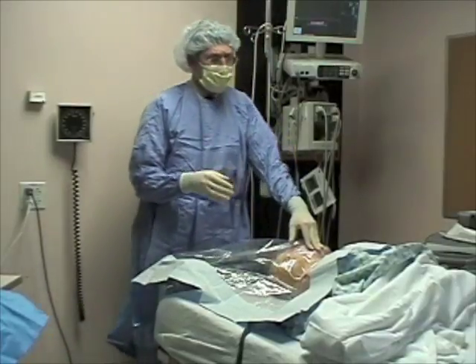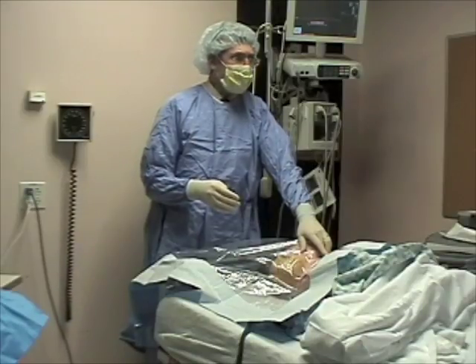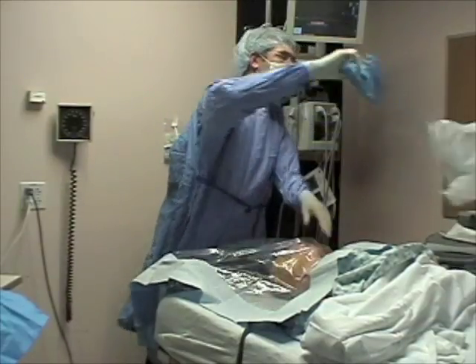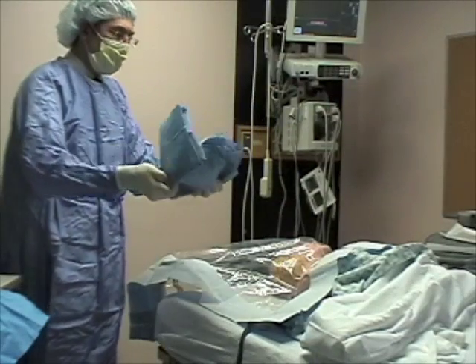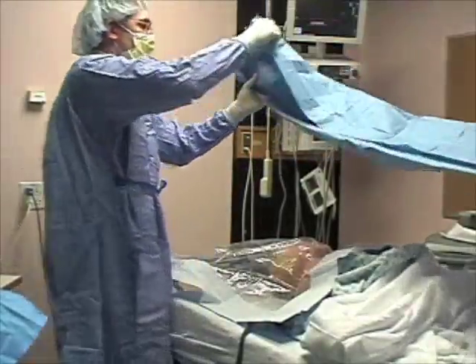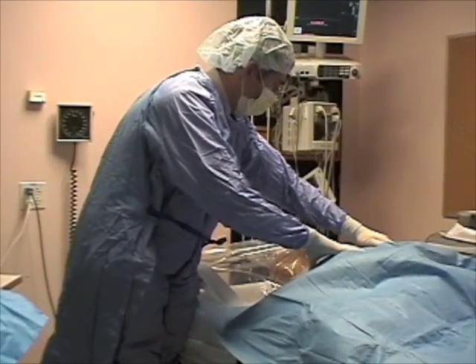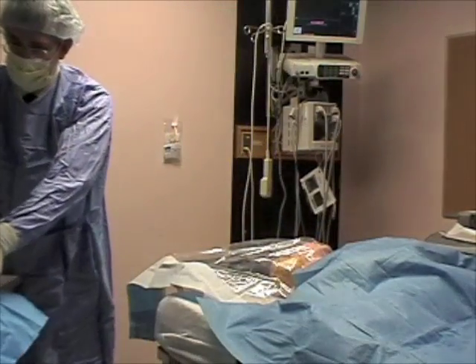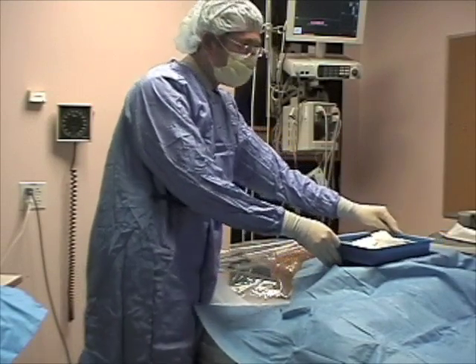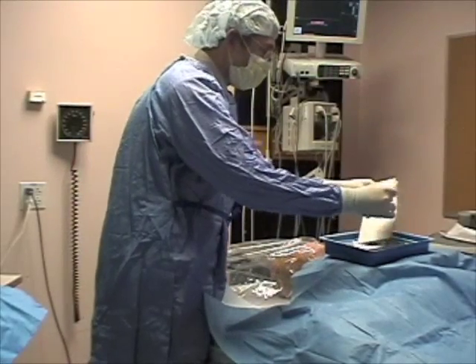Full draping also involves a half sheet, which can be opened up by your assistant. You grab one end — and because it's an unwieldy, very large thing — the best way of doing this is to hand it off to your assistant and then cover the area. For the sake of this demonstration, I'm going to put this kit on the patient. However, most of the time I do not, because any movement means you're constantly grabbing for things. So I think it's best to leave it on the bedside table.